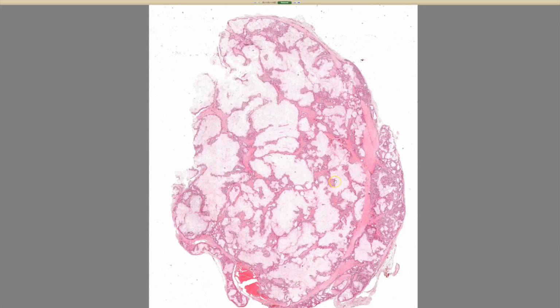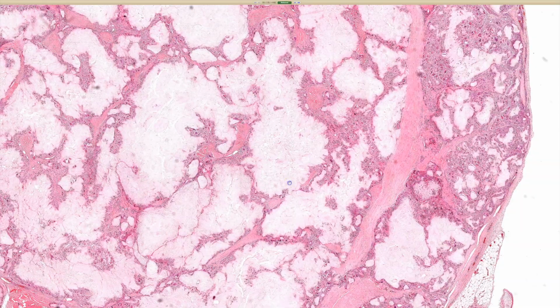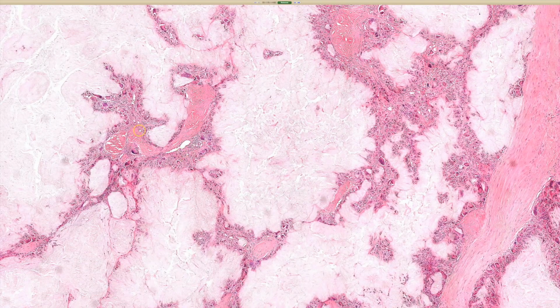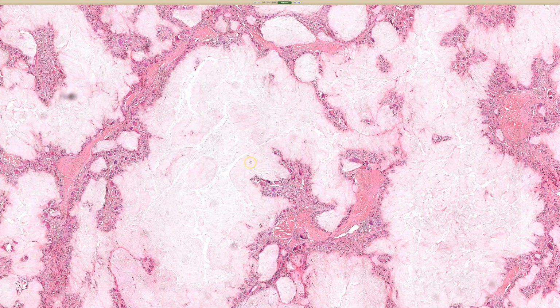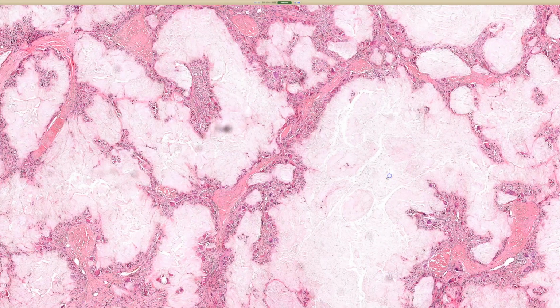I think even from here I can tell there's this weird, cloudy, kind of spiky stuff in the dermis there. And I think this is good for gout. Yeah, very good. Gout is, even without seeing the actual crystals, gout has a very recognizable pattern, right?